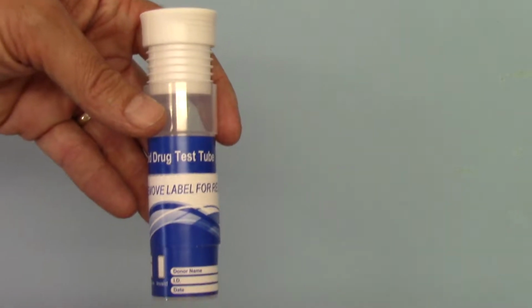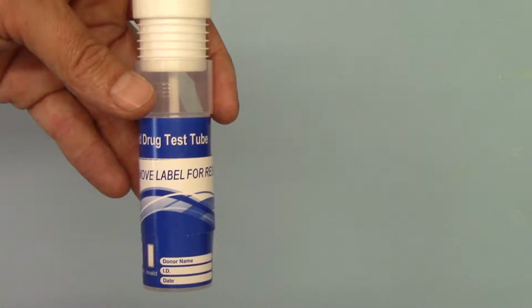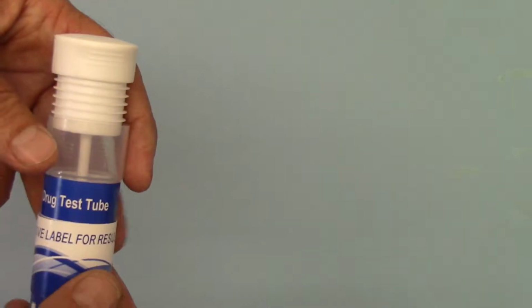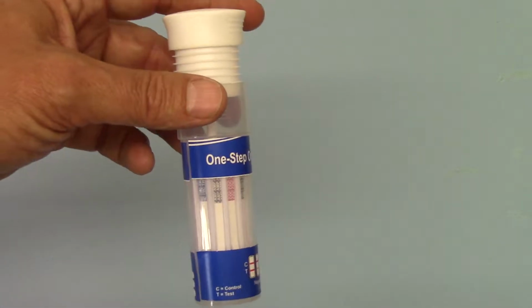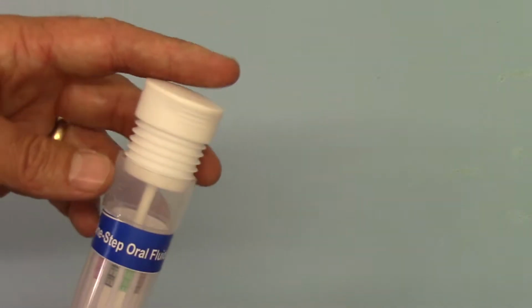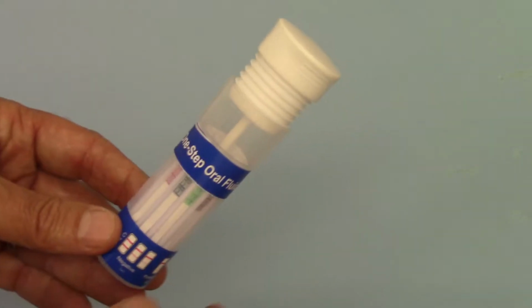Now you can leave that in place until the test 5-minute run is complete if you don't want the person that you are testing to see the results forming, or you can remove it before you start adding the saliva. It makes no difference at all to the running of the test, just a procedural option for you.